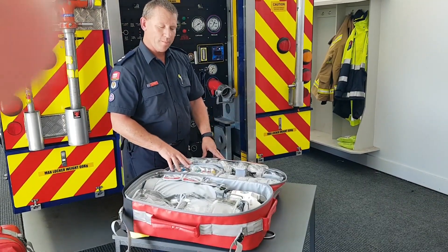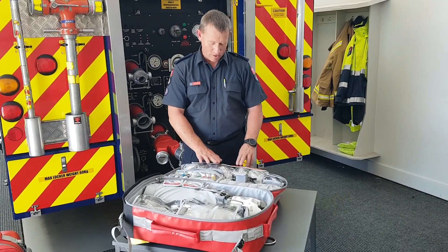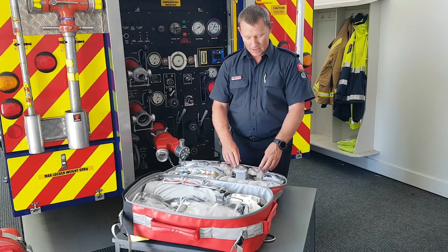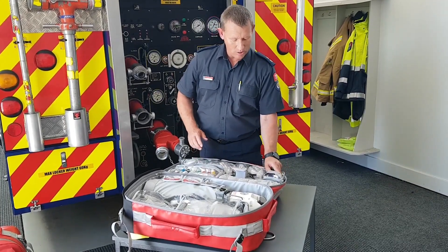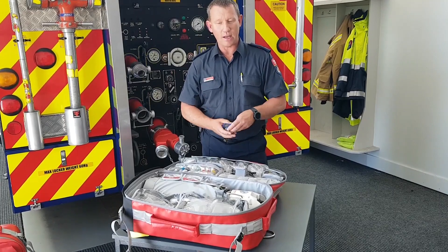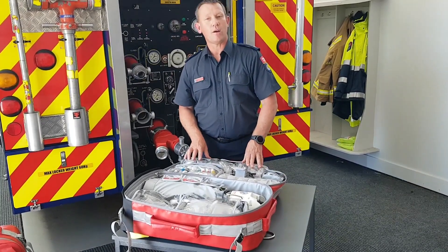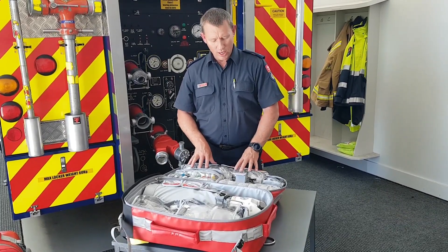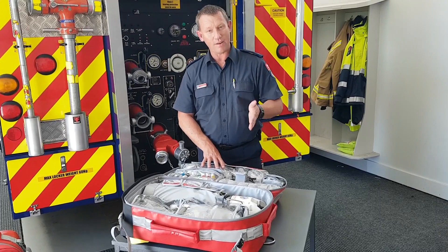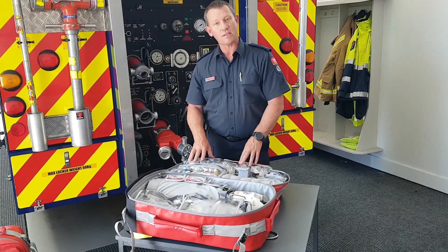Previously we just had bag masks and non-rebreather oxygen masks — the non-rebreather is now called a reservoir mask. There are two more oxygen delivery devices: a simple mask and nasal prongs, and the kit now also includes a pulse oximeter. From the ambulance service's point of view, oxygen is a medication and we need to deliver it professionally. Previous practices were running too high a flow of oxygen. What we're trying to achieve now is to provide oxygen levels that maintain a saturation above 94%, and there are a number of other criteria where you just use it anyway.